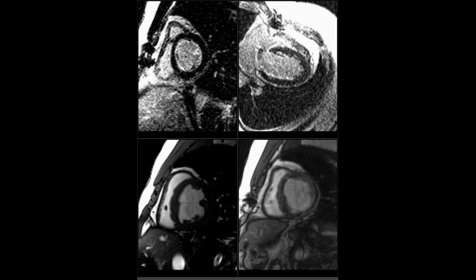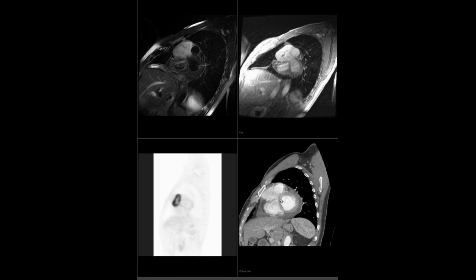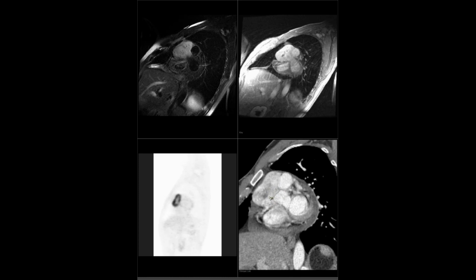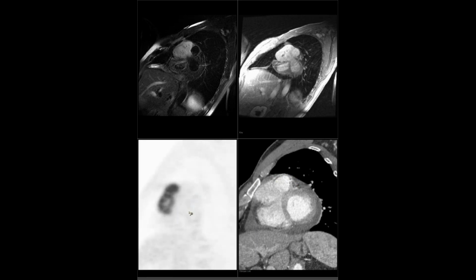Okay, cool. So the next case is a follow-up from a few weeks ago. There's this enhancing mass. I think it's either invading from or arising from the RVOT. You can see we lose the right ventricular anterior wall here. Very avidly enhancing, with some central areas that are hypodense. Here's the RCA. It looks like it's separate, but there are probably some conal branches, maybe from the LAD, that are hypertrophied. The patient went on to get a PET. You can see here on the PET images, very hot. It's a 16.7 SUV max and centrally photopenic, consistent with necrosis.